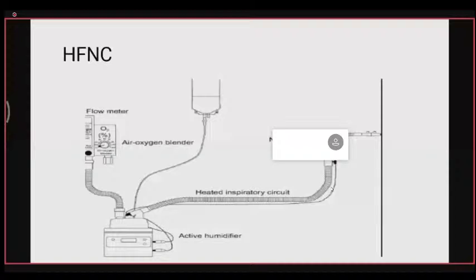That is very discomforting. So what this device does, apart from giving oxygen at a high rate, is humidify it and heat it up to the temperature set. We can set whatever temperature is convenient to the patient. Sometimes, when setting the temperature to 37 degrees centigrade, the patient feels it's quite hot. So somewhere around 28 to 29 is a good temperature option for the patient to be comfortable on high flow nasal cannula.